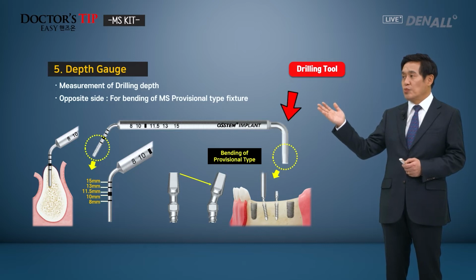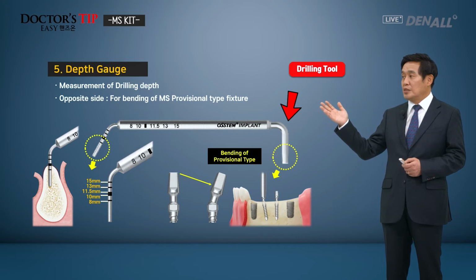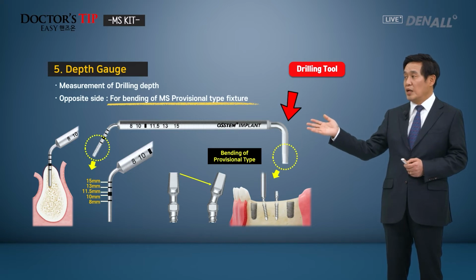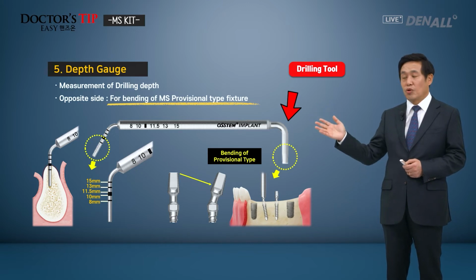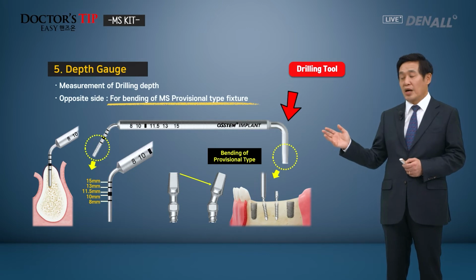And on the other side of the depth gauge, there is a special thing attached. This is for the provisional MS implant. That fixture could be bent. So this is a tool for bending. On the opposite side of the depth gauge, you have that available. And how it's bent, I will tell you in the hands-on session.